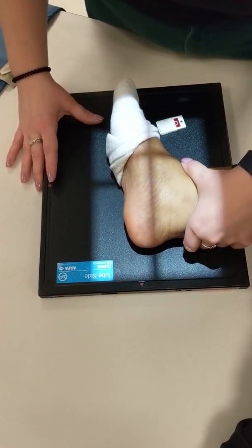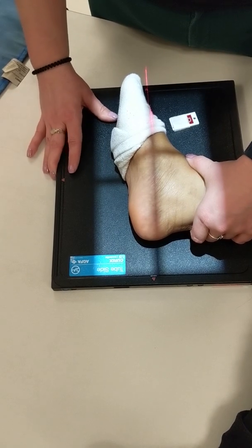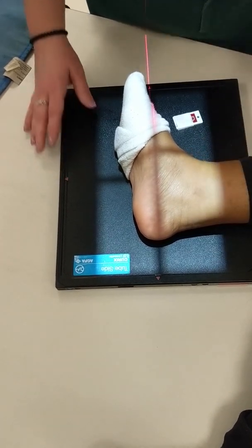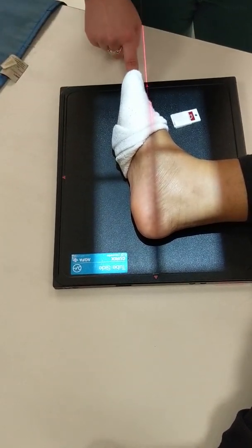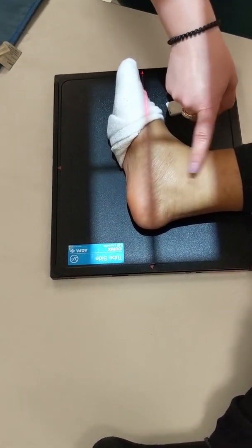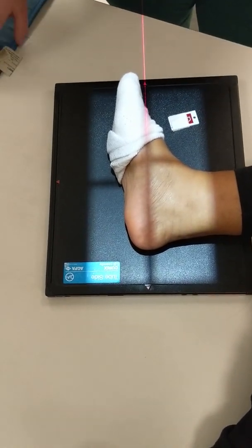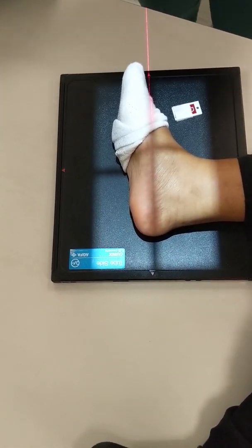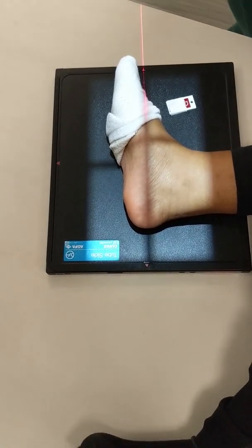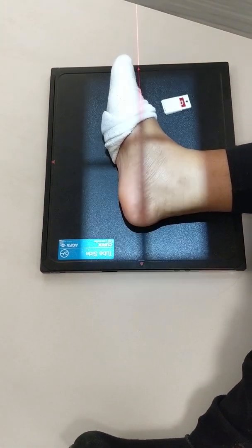Let me lift your foot up. Okay. There you go. Okay, that's better. So we've still got light past the toes. We've still got light past the calcaneus. We're including the one inch of the distal tib-fib. Okay. We're gonna shield her. And then what are her instructions? Hold still. Okay.